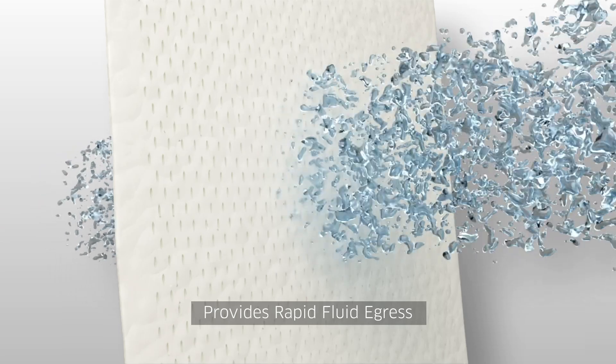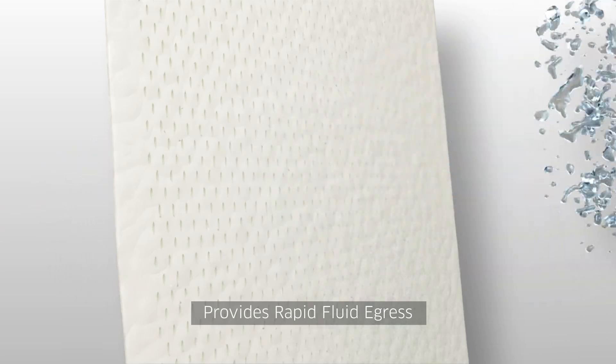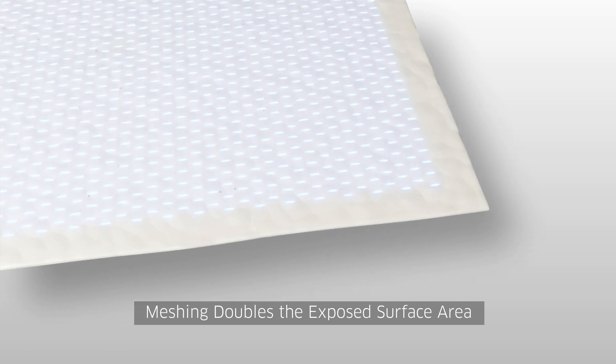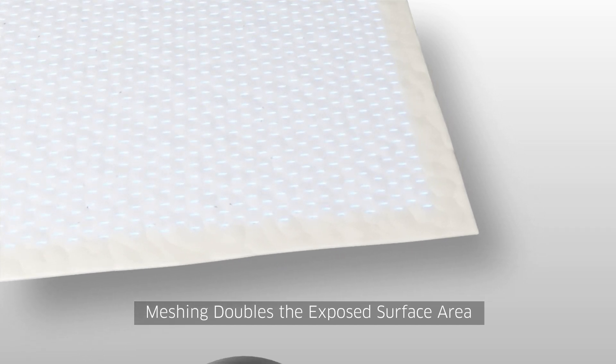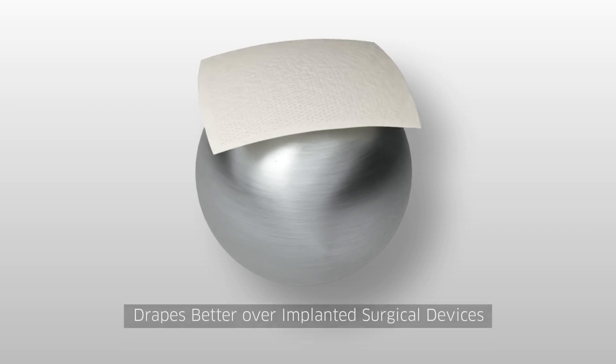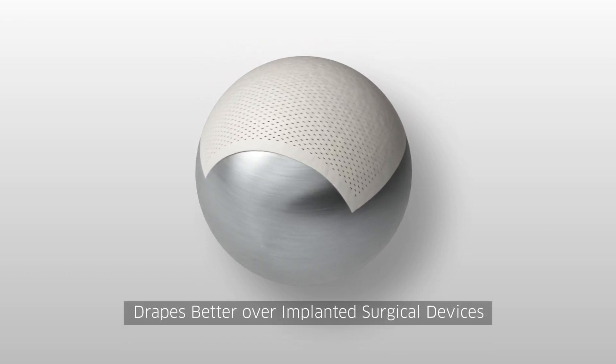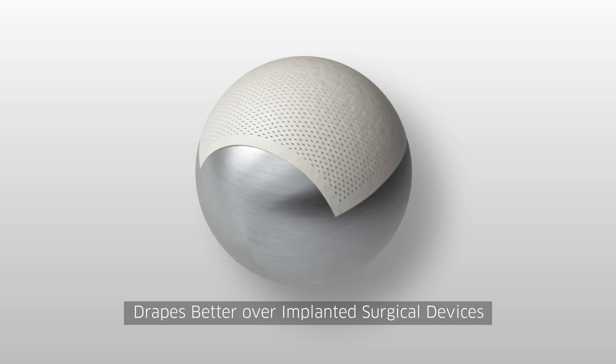AlloMend's unique meshing pattern enables rapid fluid egress through the ADM to help drain any trapped serous fluid, guarding against seroma formation. It doubles the exposed ADM surface area, translating into potentially faster incorporation, and allows the ADM to better drape over contours of implanted surgical devices, minimizing wrinkling that may hinder allograft incorporation.